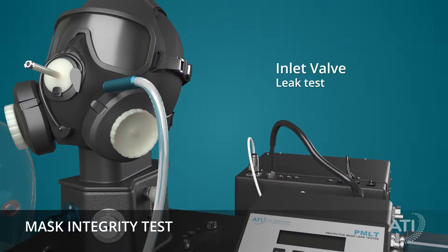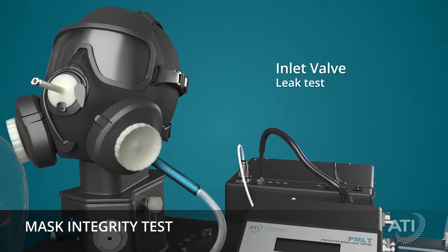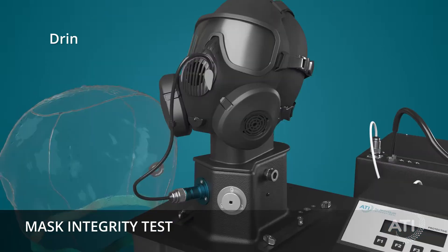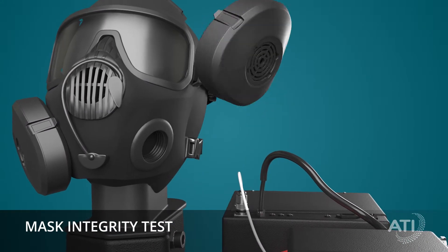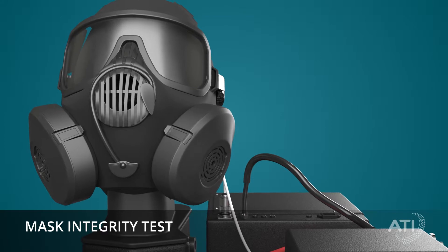If the mask fails, the operator can then isolate the source of the leak with a manual probe of each component, including the inlet valve, the drinking tube, and the outlet valve. If a leak is identified, the faulty component can easily be replaced, saving considerable time and money.